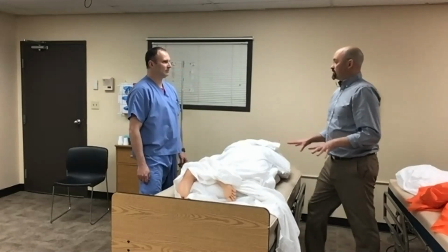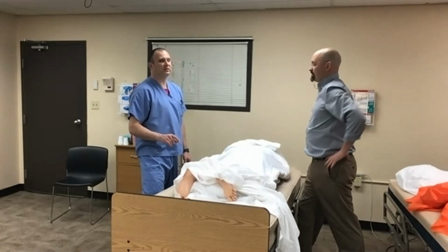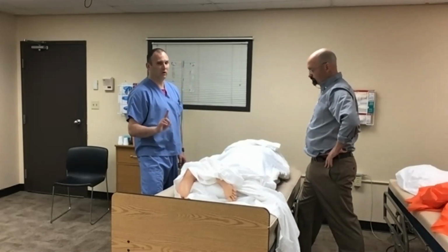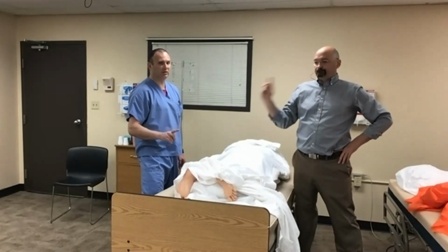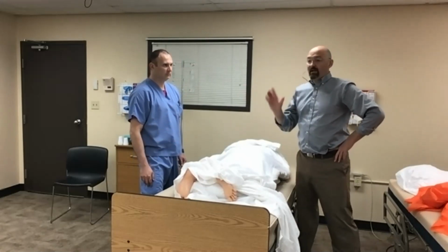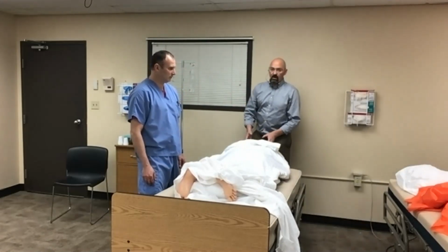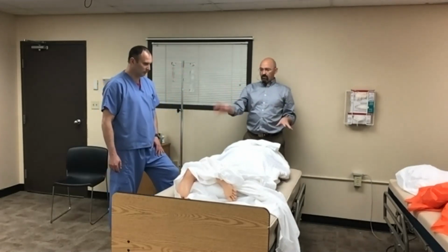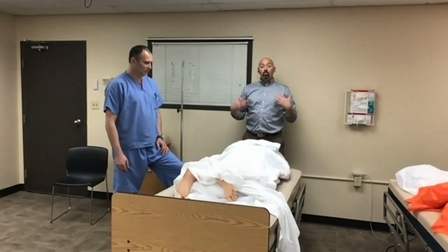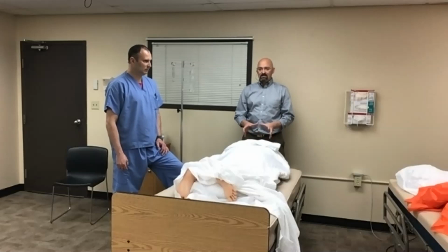Anything else on proning repositioning when it comes to this? Oh, we got to bring it back. When you're using this, one of the most important things is 1 voice, 1 command, so that everybody's pulling in the same direction at the same time. To that point, we forgot this at the beginning. With air transfer devices and repositioning slings, the person closest to the patient is the one in charge. Whenever we're proning a patient or the patient is intubated, the person controlling the airway is in charge of every turn and task that you do.